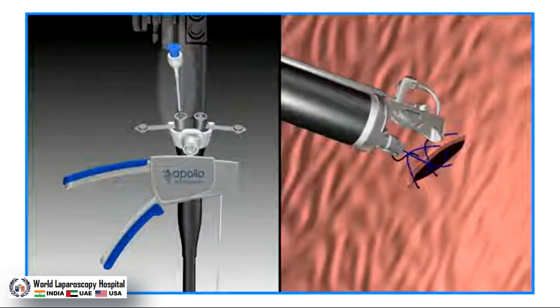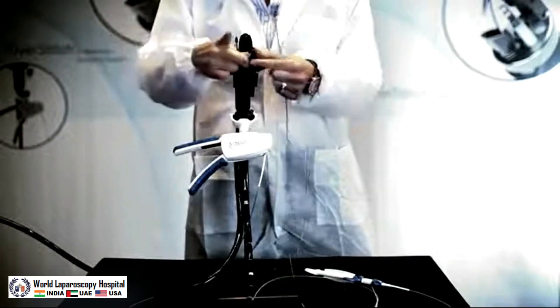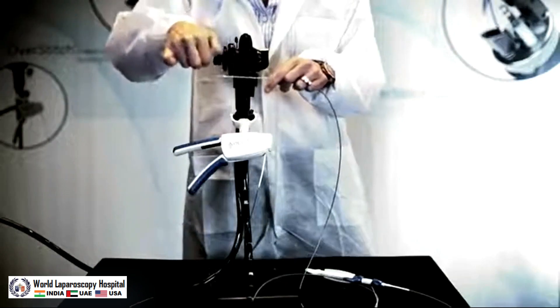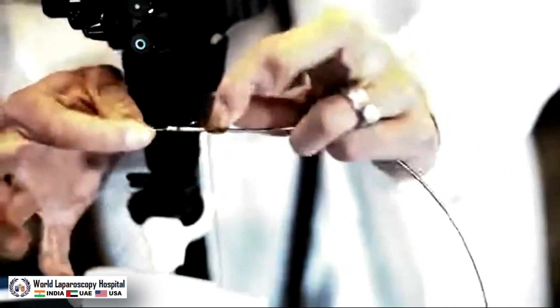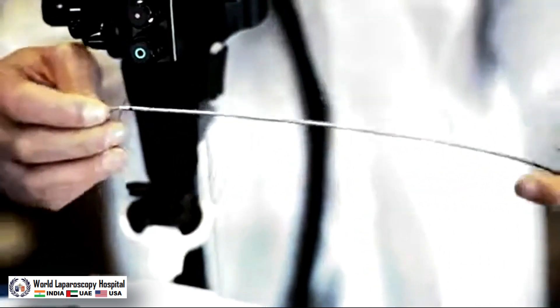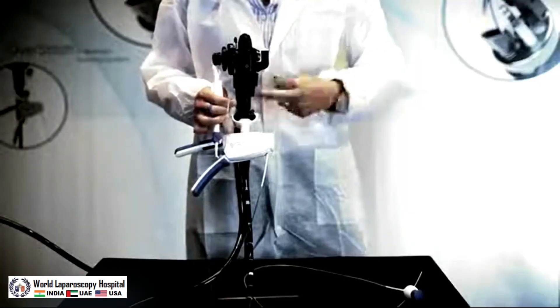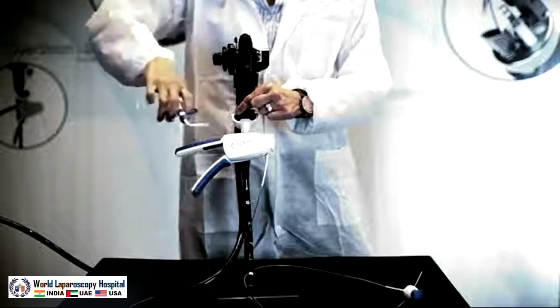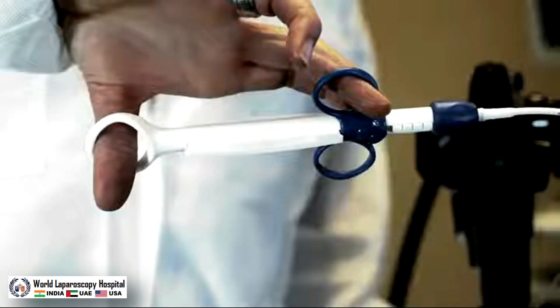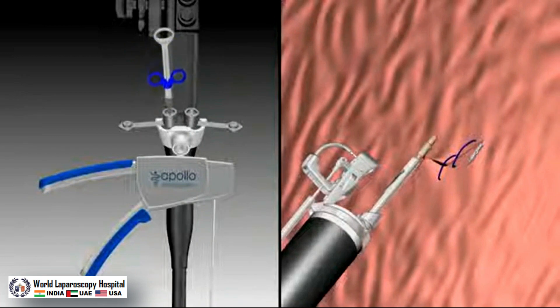Continue the loading and unloading of the anchor until the desired suturing sequence is complete. After the stitching sequence is completed, the anchor exchange is advanced and the blue button is depressed to release the anchor. Now grab your cinch and take the distal end of your suture and place it through the gold loop on the cinch. Pull a small portion of your suture through the gold loop, then pull the tab in line with the catheter and the suture will pull through the catheter. Hand the catheter off to the clinician while holding tension on the suture. Hold counter tension on the suture and while pushing the cinch forward, release the safety by pulling the thumb ring in an opposite direction of the forward two rings. Let the safety fall, then using two hands, fire the cinch. This deploys the cinch and cuts the suture simultaneously.